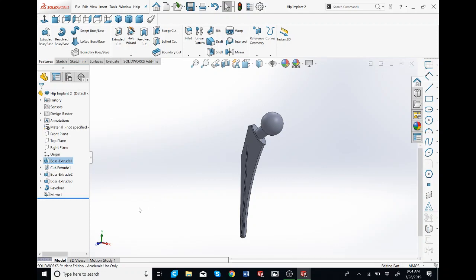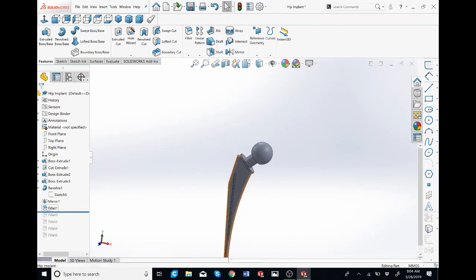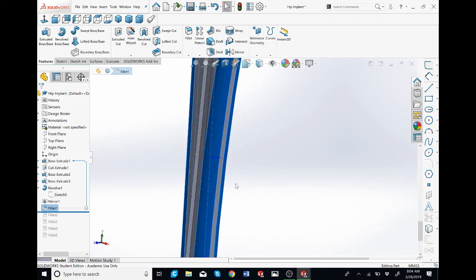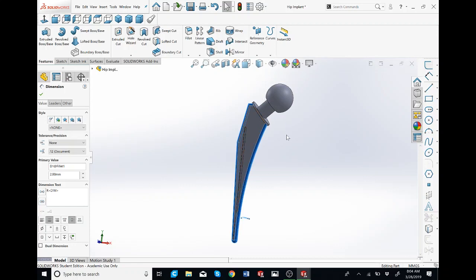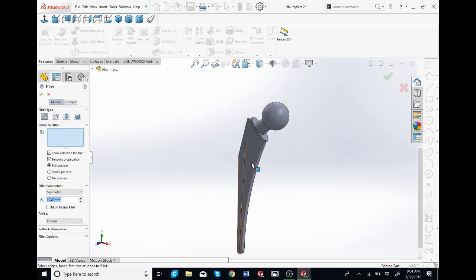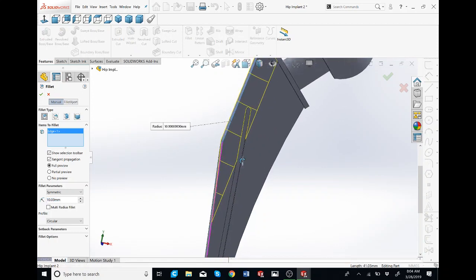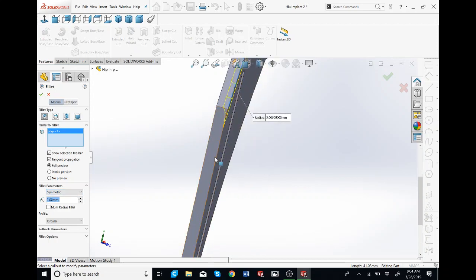Now, going over to fillets, we'll go to the first one, which I'll double click and highlight it. So we fillet both sides, and over here you can see the dimension, which is 2. All you have to do for this is click on the fillet tool, click on the edge. You see this pops up. Sometimes you have it where you can have the edges that you want. Over here, internal edges, 13 edges. But it's not everything because I have different sizes for each one. I'm going to make this 2. I'm actually going to click every edge around it.